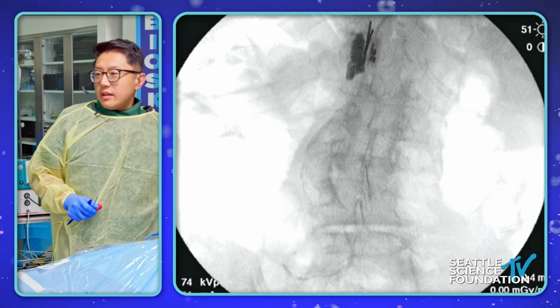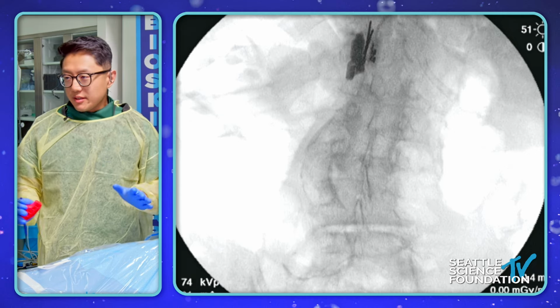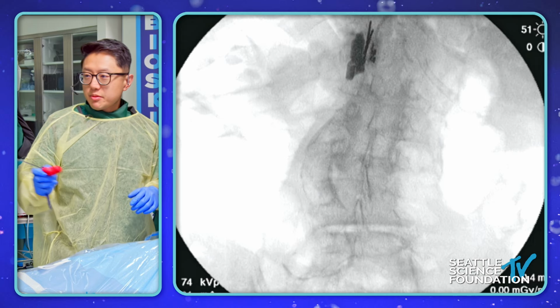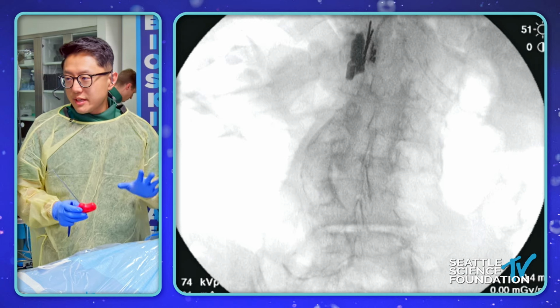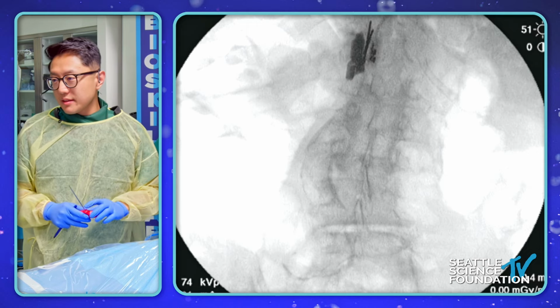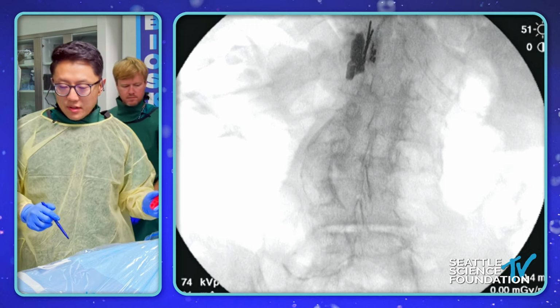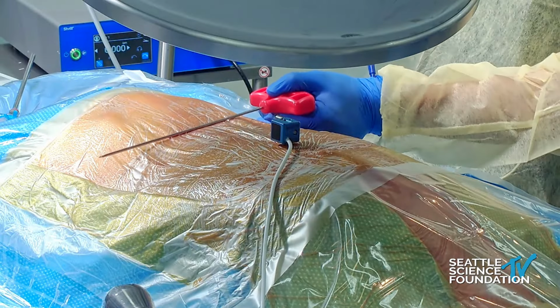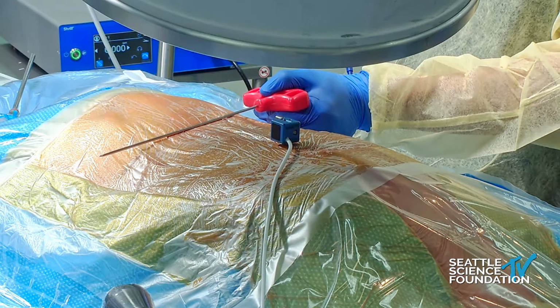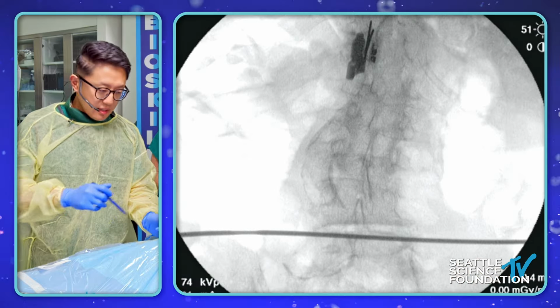So, as John was saying earlier, the biggest thing is you have to have a perfect x-ray, right? Perfect AP, perfect lateral. And then the end plate looks pretty reasonable here. There's quite a bit of rotation, as you can tell, but the pedicles look probably the best that they look based on this picture. I usually mark out the vertebral body of the disc of the body below. So let's take a shot there. One more shot there. Okay.